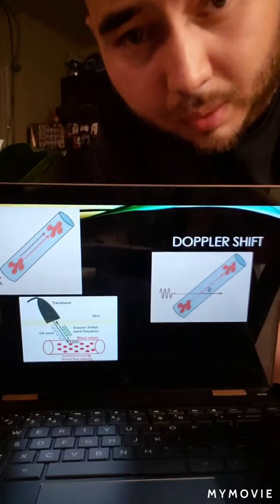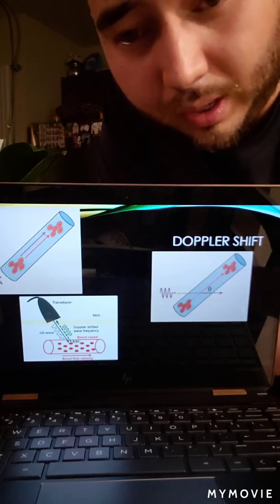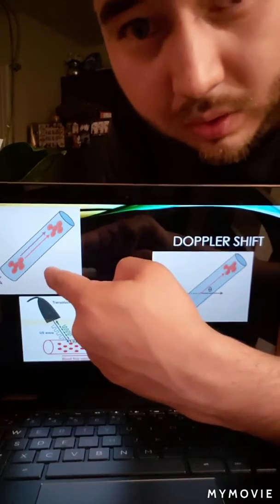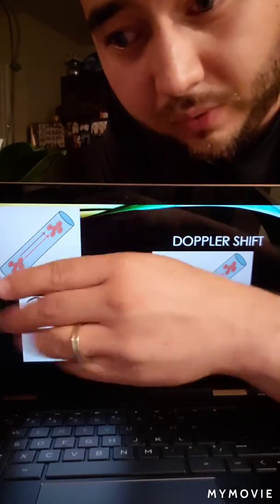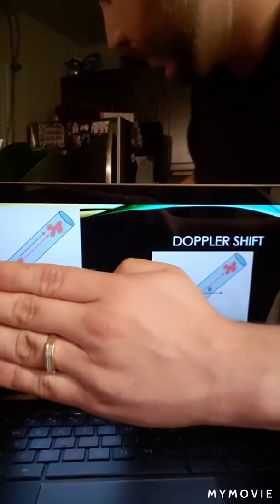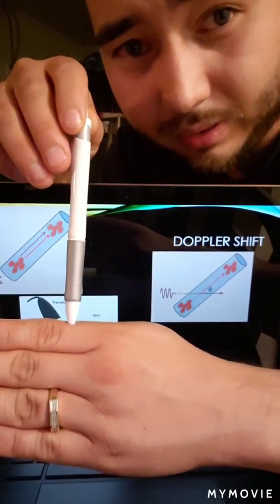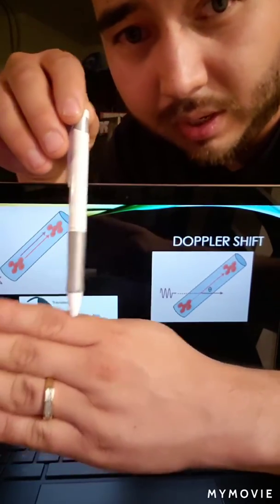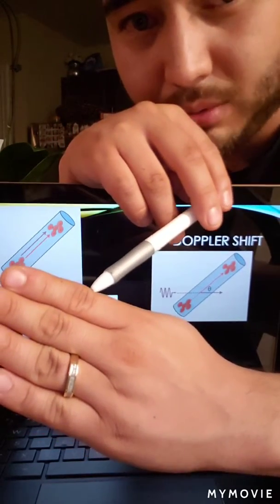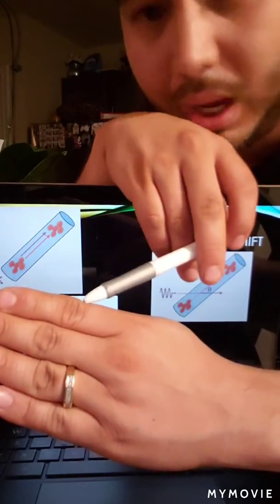When scanning with color Doppler, it is very important to get the transducer as parallel as possible, and what I mean by parallel is this image right here, to the blood flow. If the vessel is traveling at an angle, you cannot hit the vessel at a 90-degree angle because that would not be an accurate Doppler shift at all. If the vessel's traveling up, you heel-toe your transducer to get an angle of 60 degrees or less, measured from the skin to the top of the pen.